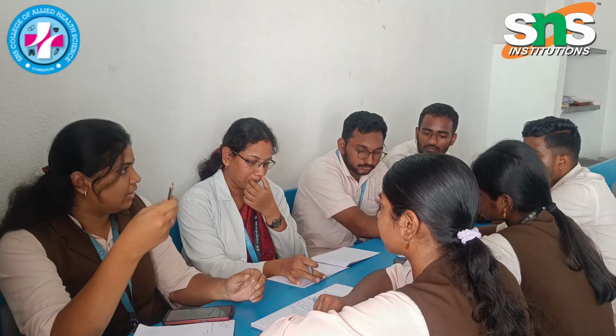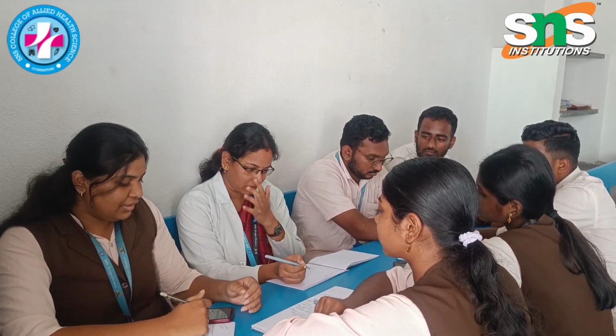For instance, if the surgery is taking place in the aorta, the heart will be beating, and from the heart, the upper side of the body, that is the brain and those organs, will receive blood. The lower side of the body will receive blood from what we give. Blood will be taken from the right atrium and then given to the lower body by placing a cannula there. So, if we see the advantages here, what do you think?